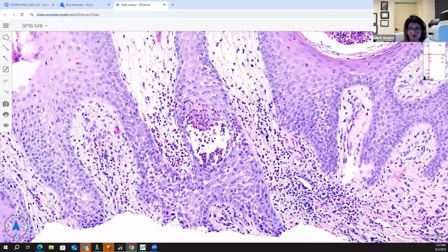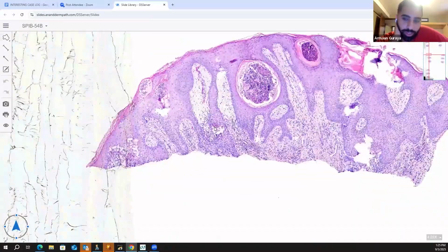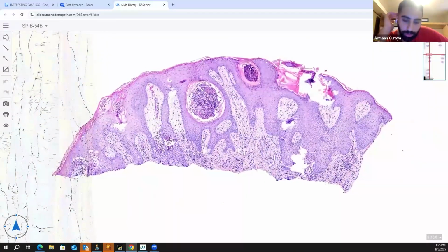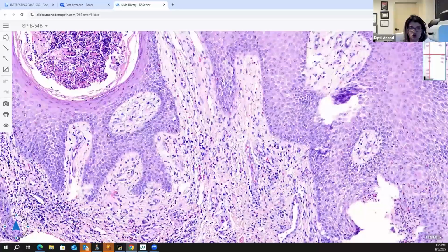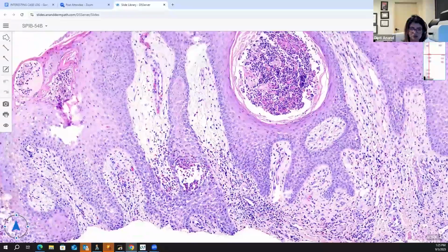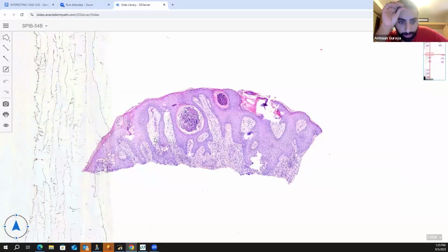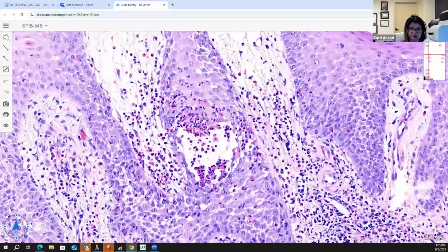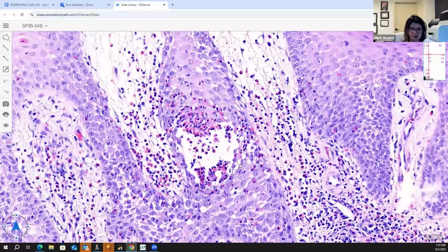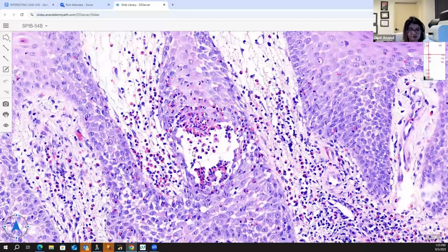Yes, this one I thought saw intraepidermal vesicles with eosinophilic spongiosis. So that kind of put me in contact versus bug versus drug-induced eczema. Okay, so how does the epidermis look? It's kind of irregularly acanthotic. Yep, it's pretty thick. And then you saw the eos in here. How do you describe this collection of eos in the epidermis right here? A microabscess. Exactly. It's an eosinophilic microabscess.